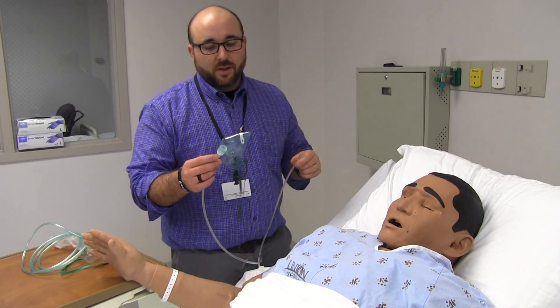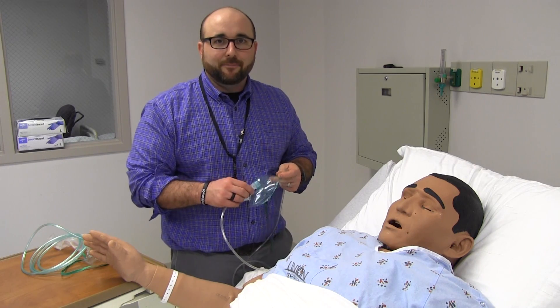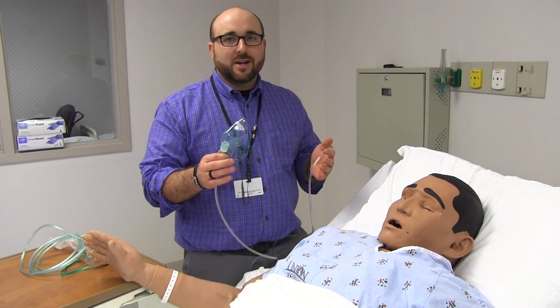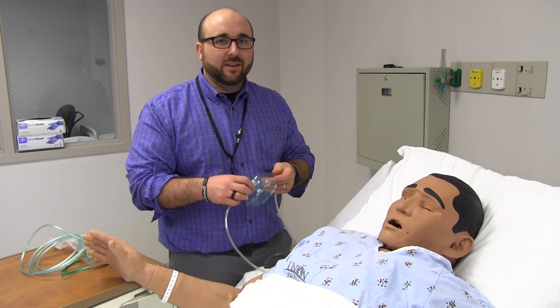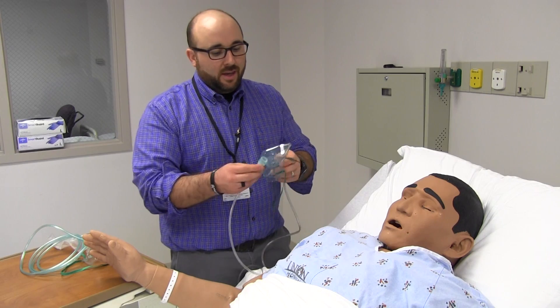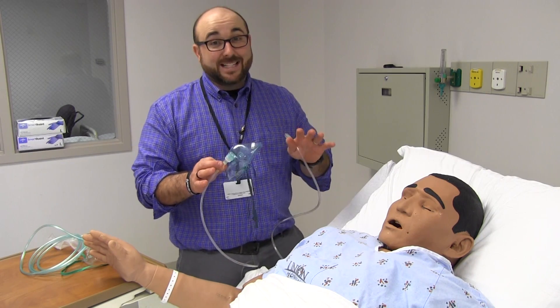I'm going to talk about the simple mask now. A simple mask is a device we see a lot in our post-surgery area. It's a nice way to deliver some oxygen. I've also seen it in labor rooms — they give it to a laboring mother who needs oxygen but doesn't like nasal cannula. It's a nice way to deliver oxygen, but it's a very poor way to give an exact amount of oxygen.